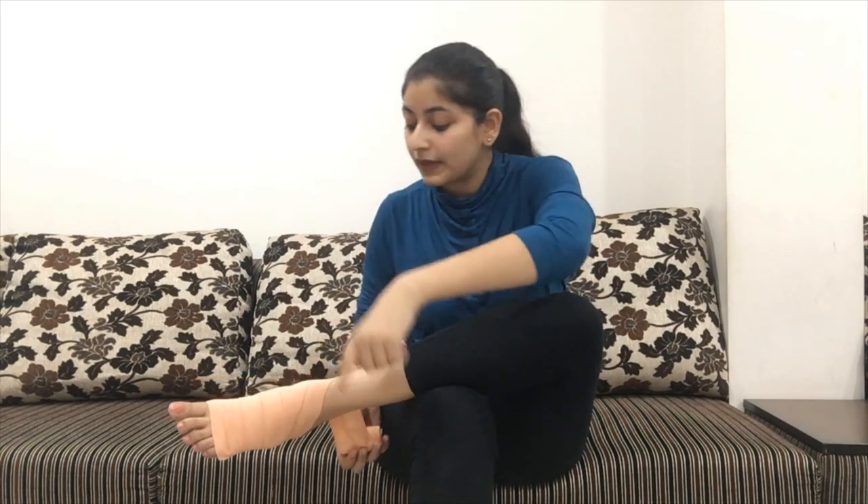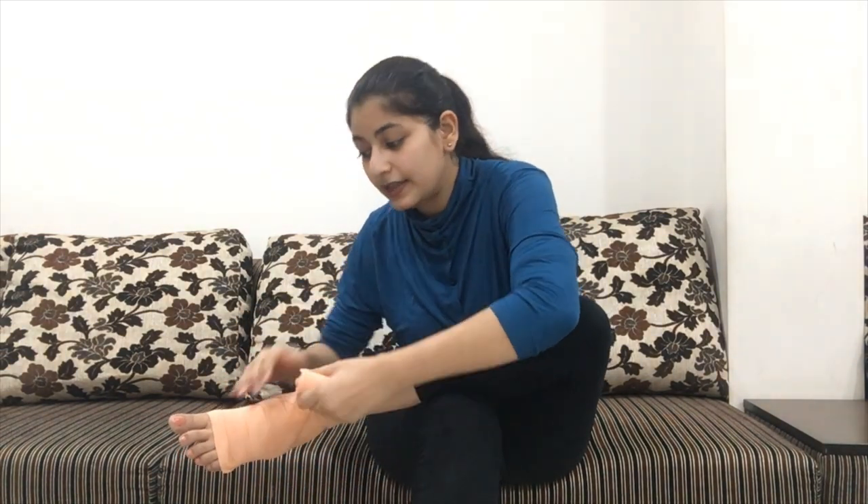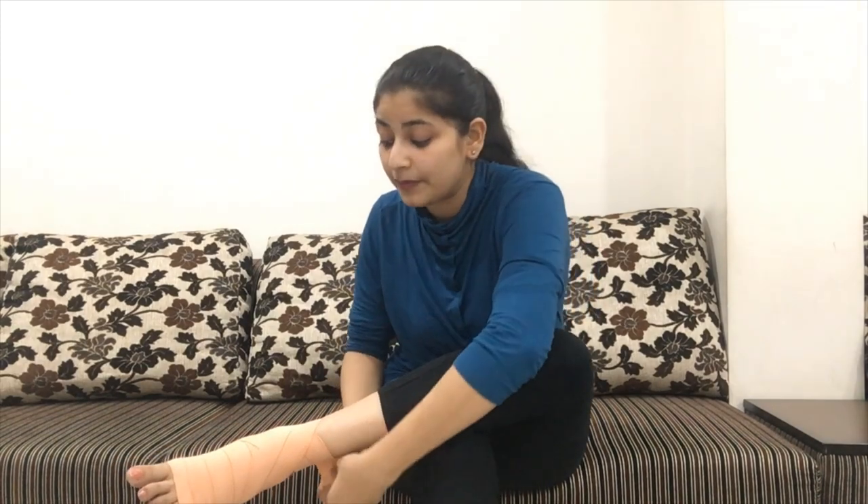So once this happens, if you see this, this is diagonal. And then we take one more round, going just behind the heel. Vahan se ek aur round lete hue, phir se upar aate hain. Yahan se ab hum pressure thoda kam karte chale jayenge, mainly because swelling kam hoti chali jaati hai. Aur saath saath mein ankle ko ek support diya jaata hai. Agar aap dekh rahe ho to see, this is very much following the design, kyunki main half pe hi overlap karte chala jaa raha hoon.